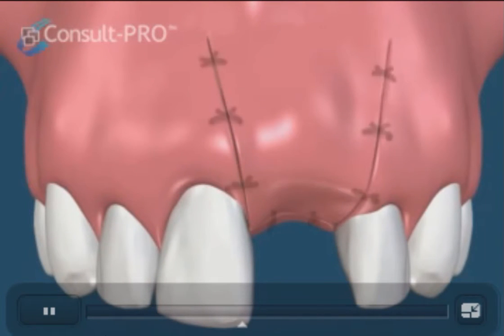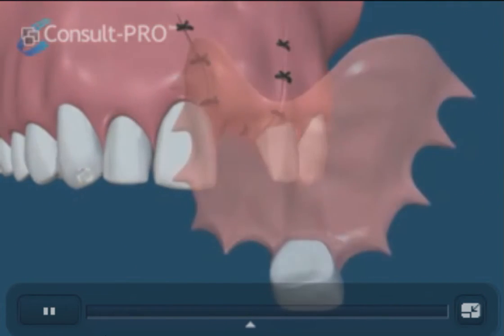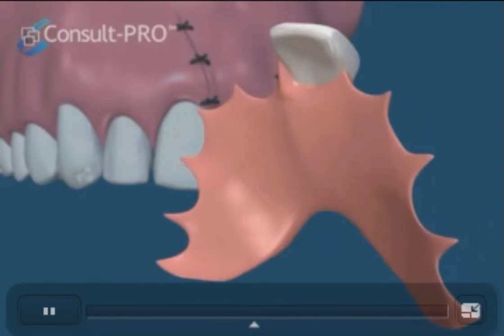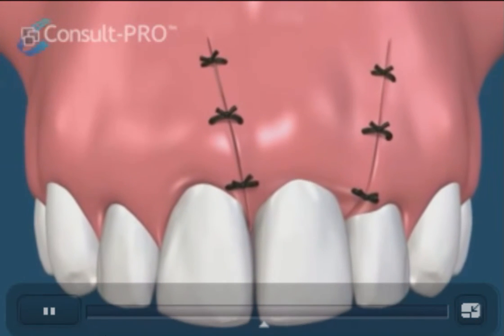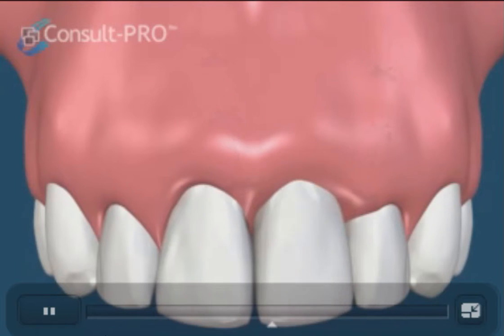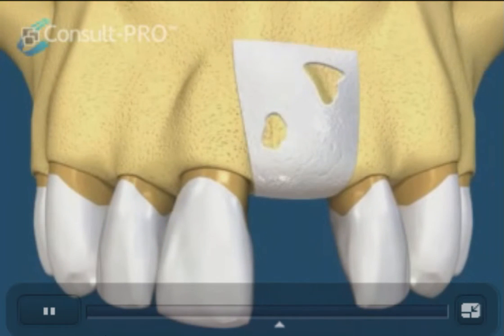The patient may wear a partial removable denture during the healing phase as a temporary tooth replacement option. The sutures will be removed, or dissolved if self-dissolving sutures are placed. Underneath, the membrane will dissolve while maintaining the area and preventing ingrowth from the soft tissues or gums.